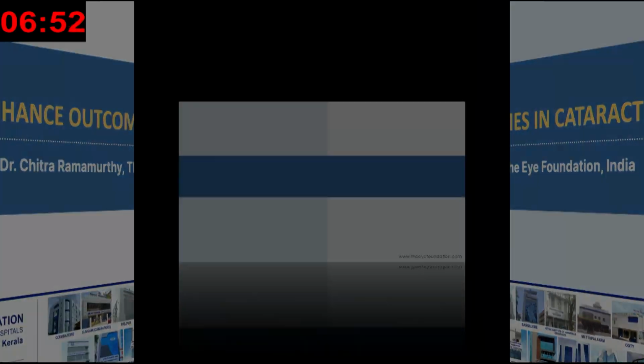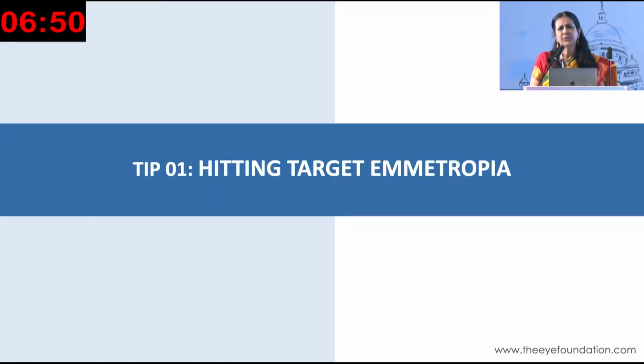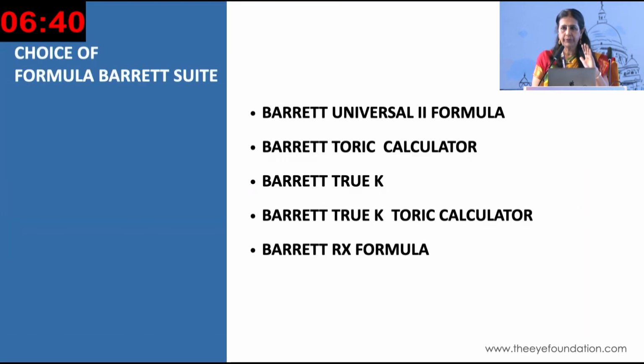My tips are something that maybe all of us could connect with, very simple and very much day-to-day pearls. Like, how are you going to hit target emmetropia? Now, all of us want every surgery of ours to hit target emmetropia. And for this, I have given the choice of using the Barrett Suite with all the formulas.